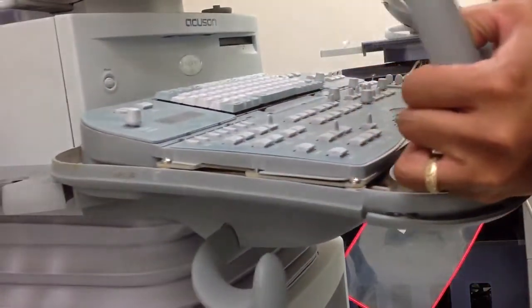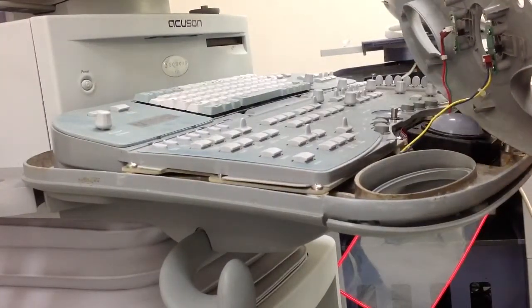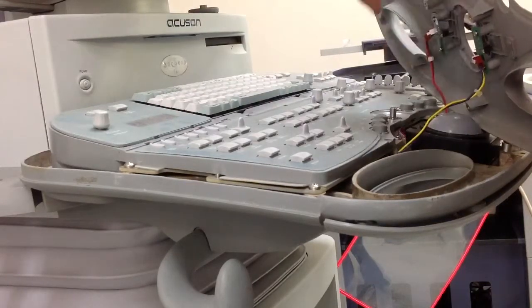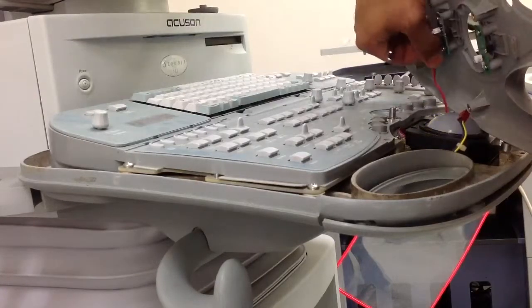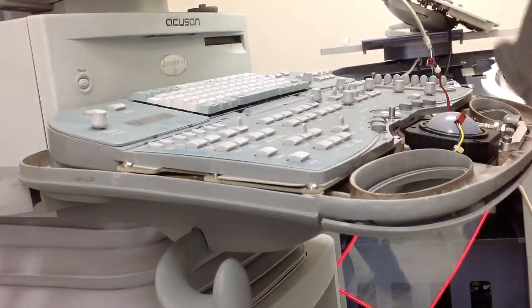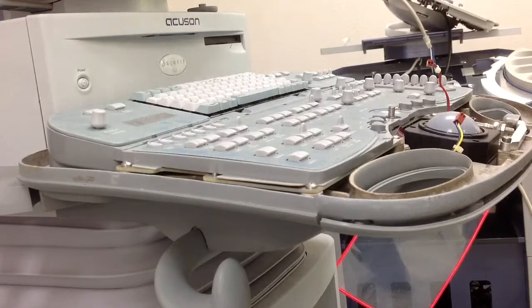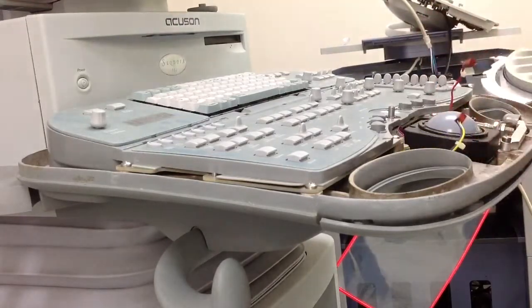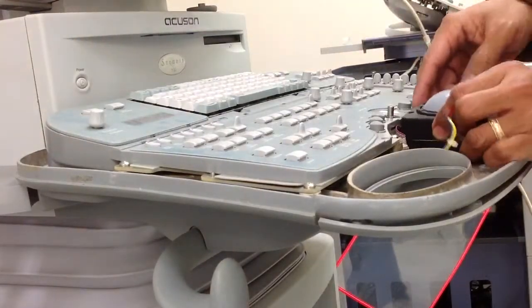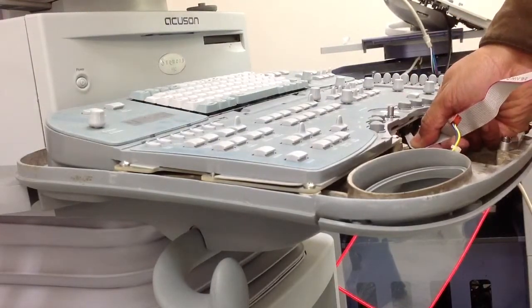There are going to be two cables at the bottom connected to the left and right set key or kidney key. Remove that by pulling it. Make sure before you start doing this, turn off the machine and unplug the power from the power source. The next thing to do is remove the trackball. Just pull the trackball up and then pull the cable downward.